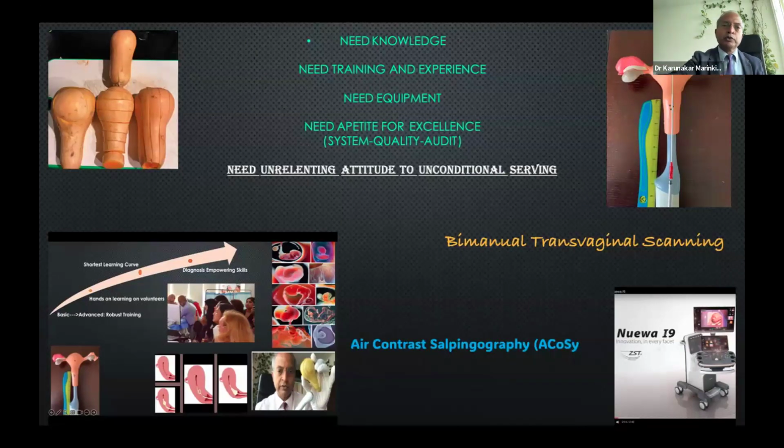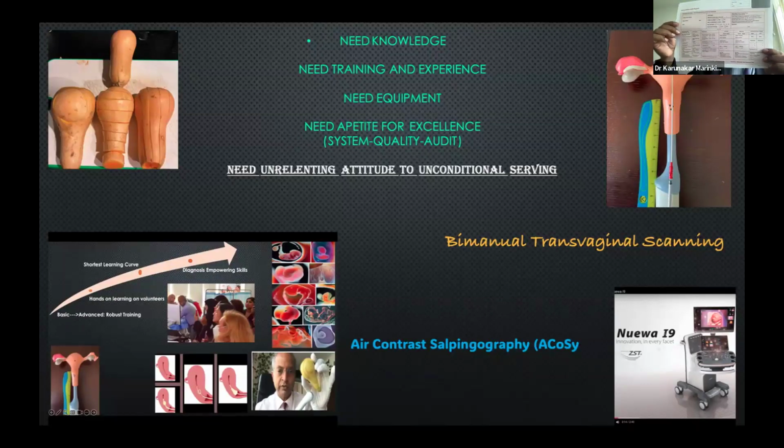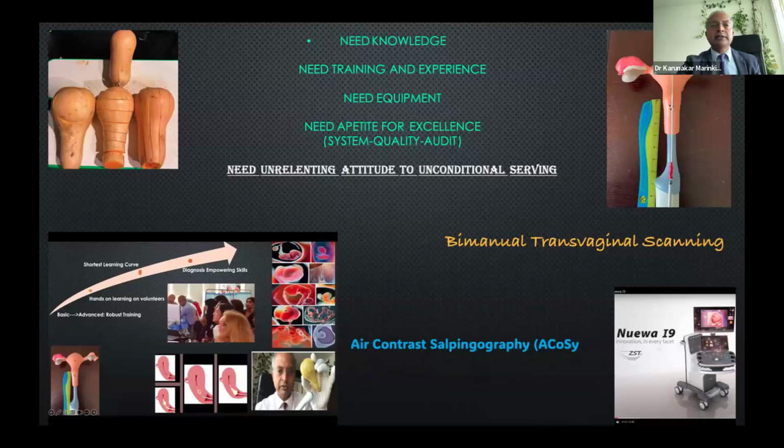If I'm going to go through this list properly, this is my template. Almost 32 points I see in 5 minutes. This is my master ultrasound template. It's there in the slides I'm going to show you. But you will be filling that in to say at some point, sorry, I could not see very well. Ultrasound is no longer valid. Then I go to MRI, then I go to CT scan, whatever it takes. I'm sure you all understand. We still use MRI for fetal medicine or fetal sonography because ultrasound has limitations.